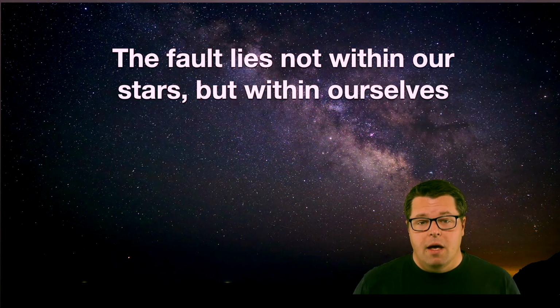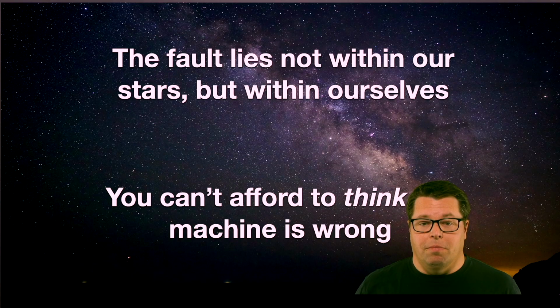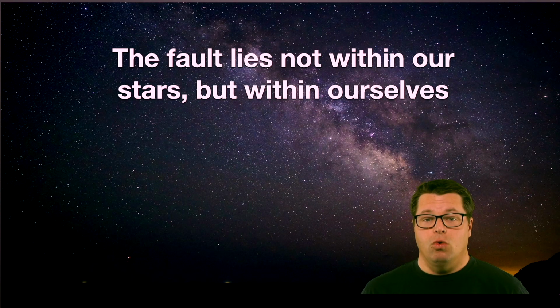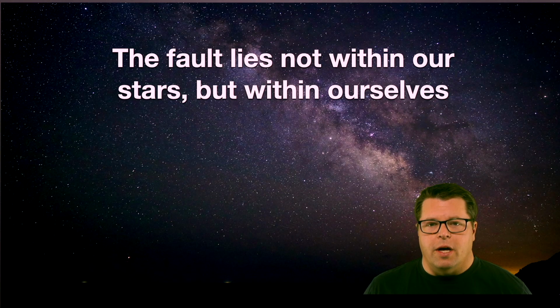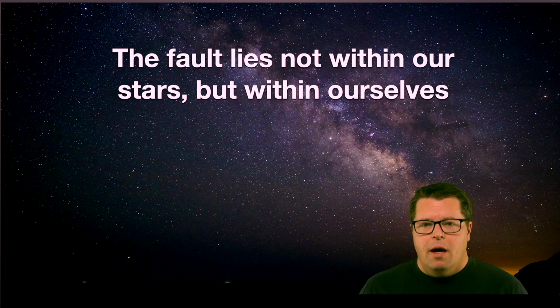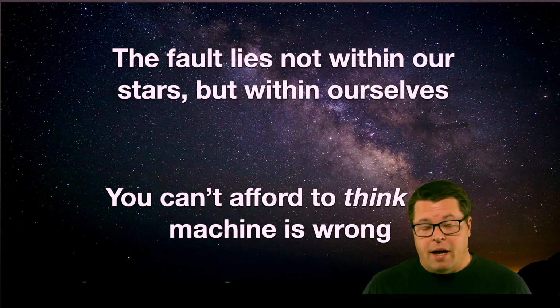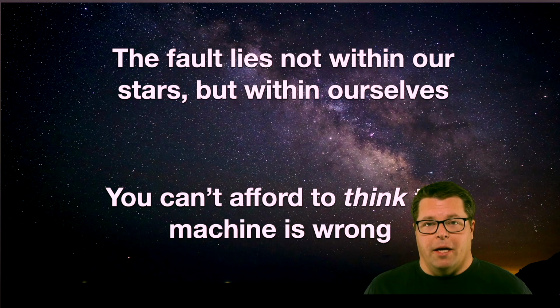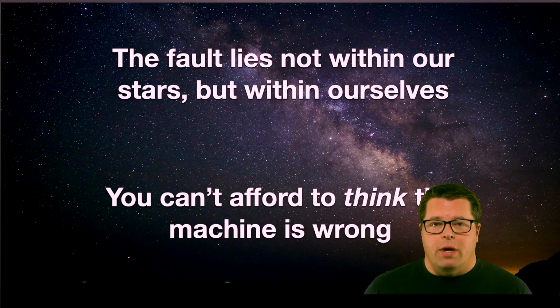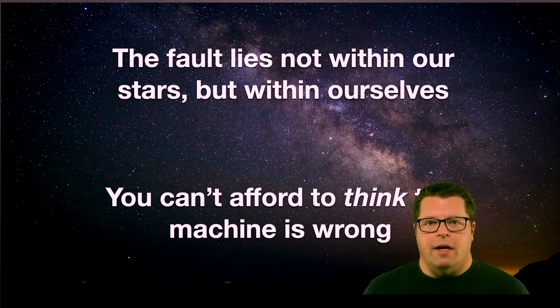Typically speaking, if we believe that there's a machine fault and that's why we're not getting an end tidal CO2 waveform, we're about to hurt somebody. We cannot afford to say that there is some kind of malfunction and thus assume that the end tidal CO2 is not reading because it's the machine's fault. And well, yeah, those things break all the time. That's not good enough, because the downside is that we will absolutely kill somebody when we assume that. Now, you may be able to prove it, but you cannot just assume that the end tidal is not coming up because the machine is not functioning.